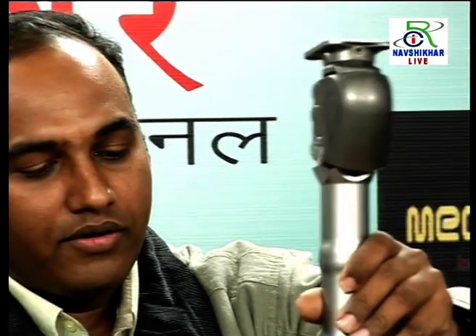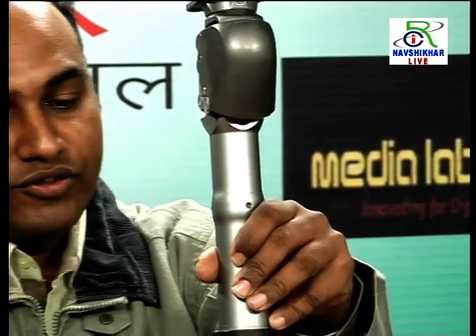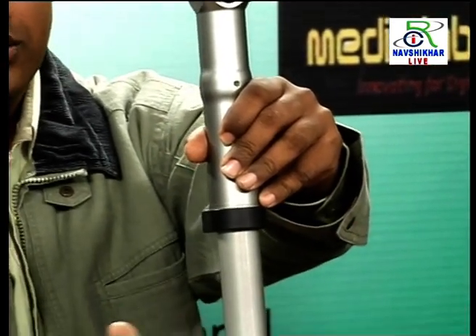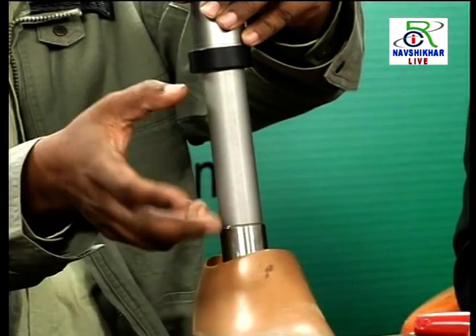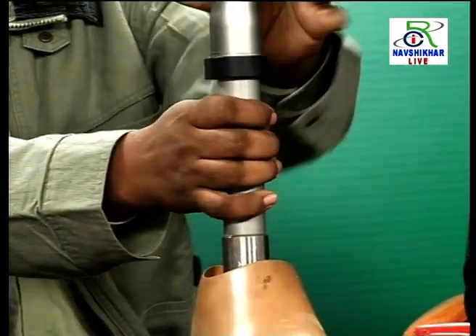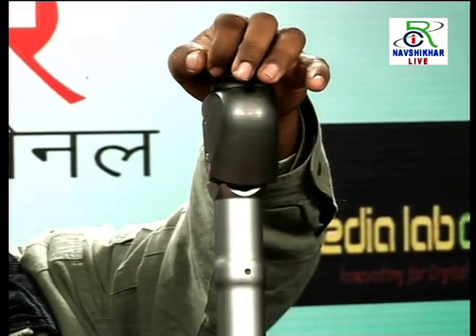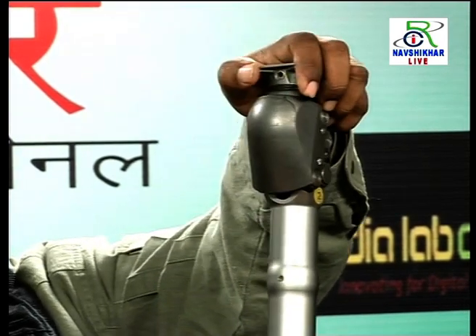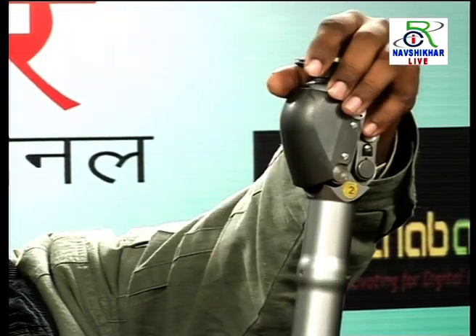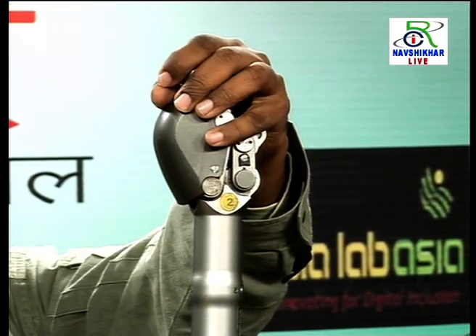Now we have an above knee system. Right now I don't have a socket, but you see the foot system. We have described the foot system, and the patient chooses according to his choice. Now we have a pylon, which is also chosen by the patient according to his choice. Now the knee joint, the four bar linkage, we have described. Now comes the five bar. Right now I don't have a five bar, but the fifth bar is another added feature.